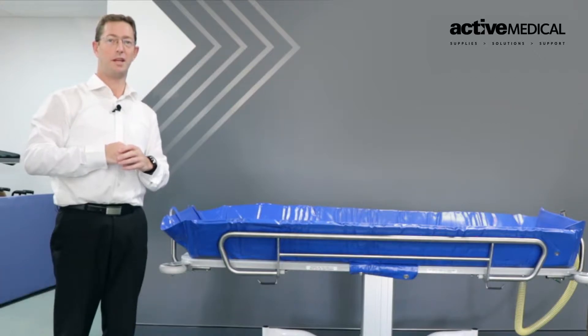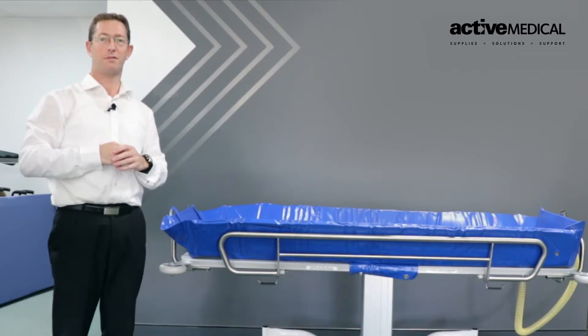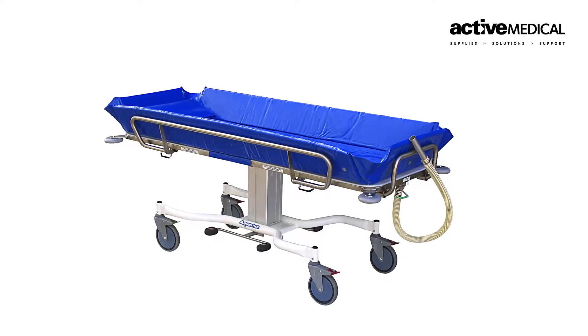Welcome to your latest purchase, the Active Medical Shower Trolley. We assure you'll get many years of use from this product in your training facility. What we'd like to do is run over the functions and features of this product to ensure they are used safely and to their full benefit.